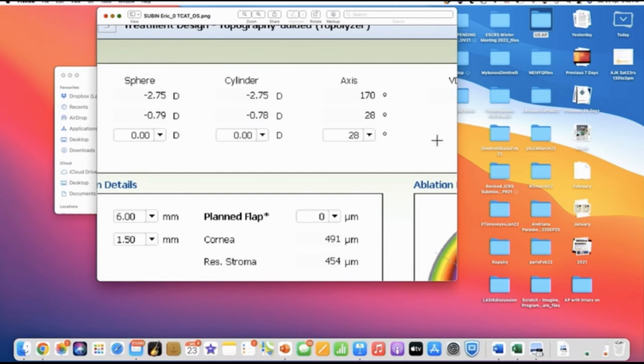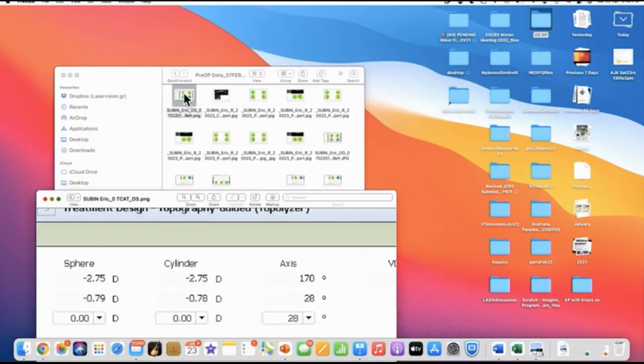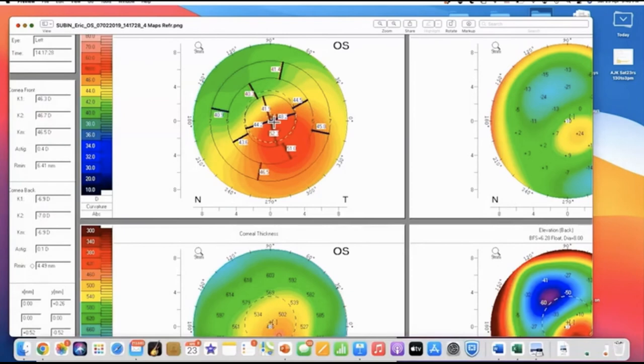Why is this happening to this patient? I think we talked about it before. It's happening because the patient is not seeing through here. The patient is seeing when he's refracted somewhere around this line here. And what's the astigmatism out here? Only God knows. It's what the patient is able to get the best possible image. That and squinting and tilting his head and moving around, et cetera, et cetera.